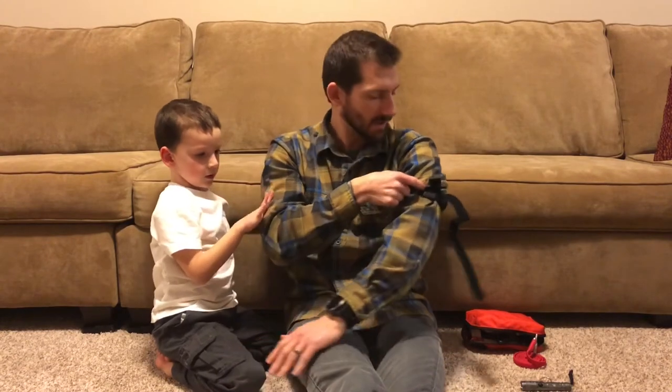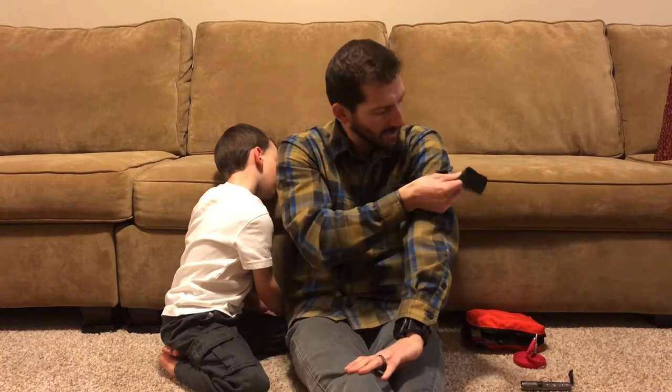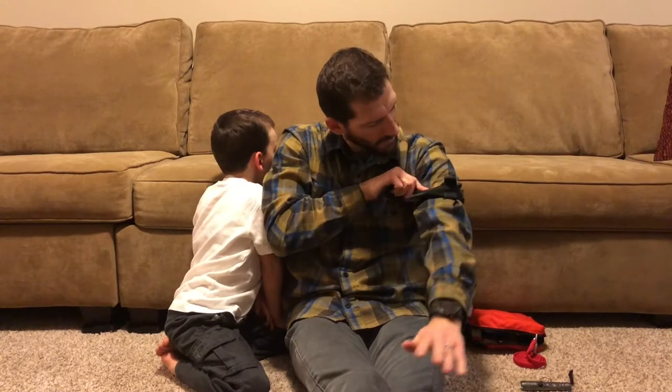Once you've got it nice and tight, take that windlass and crank it. In a real-world scenario you'd probably crank it about three full twists. Secure the windlass in the clips, then take the rest of the strap, put it underneath and over top of the windlass, and then take the last piece of Velcro and strap it over top. Try to keep it on the outside so that if you passed out, whoever is responding on scene would be able to see that tourniquet.